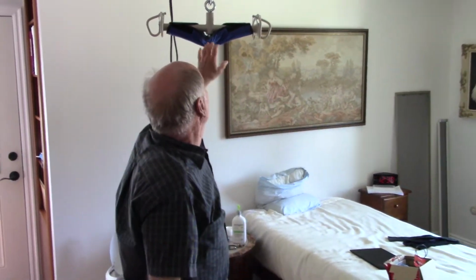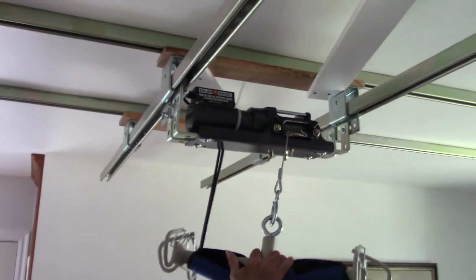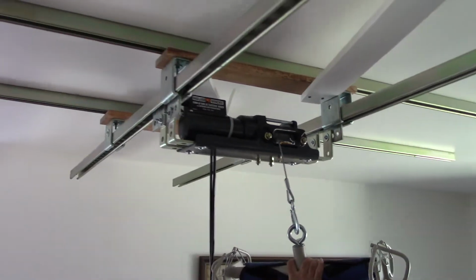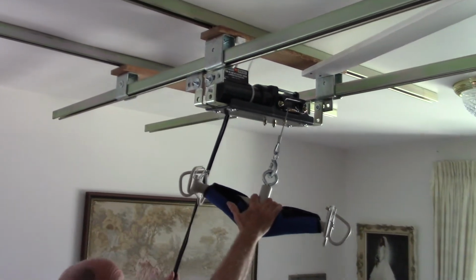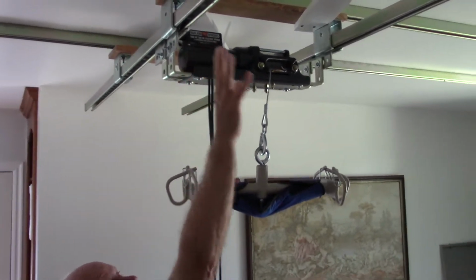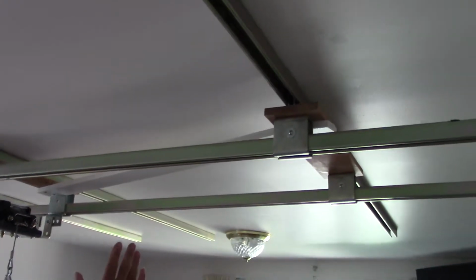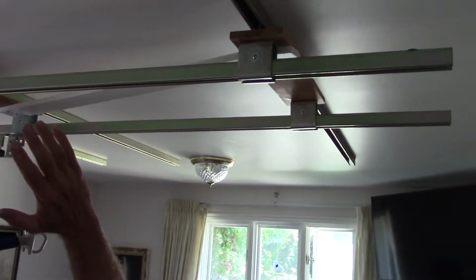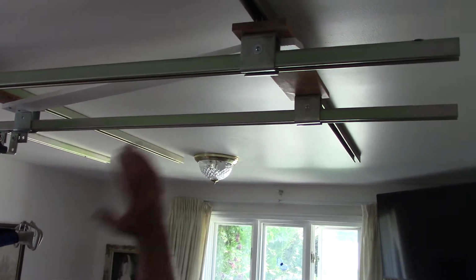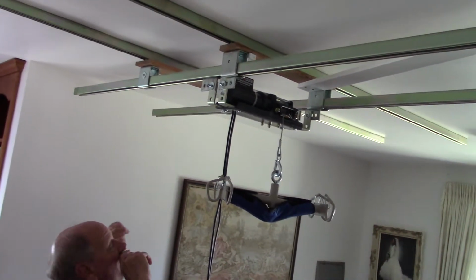But they make a wheel which runs down the unistrut. So what we did is we got two sets of wheels and we made it so that it would go back and forth, and then we attached a winch here. So we got the five pieces of unistrut. The trusses in this room, in the ceiling, are running this way. So we got 3 here, you could do 4.